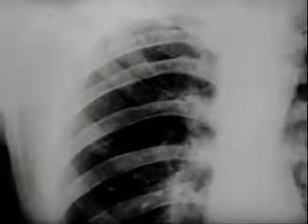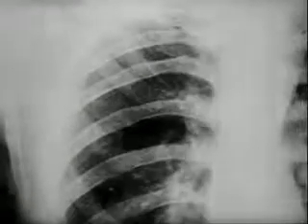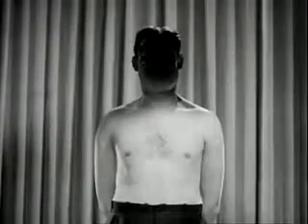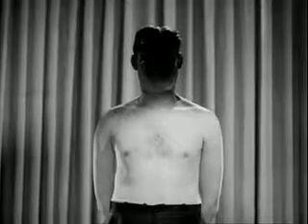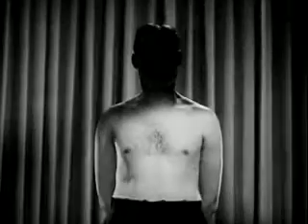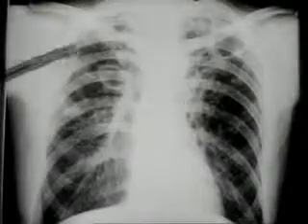We expected to find great lung damage, but the X-ray revealed this minimal lesion in the lung. This athlete boasted of his great physical strength and belittled his cough and sputum, ascribing it to cigarettes. The X-ray revealed this multiple cavity formation.